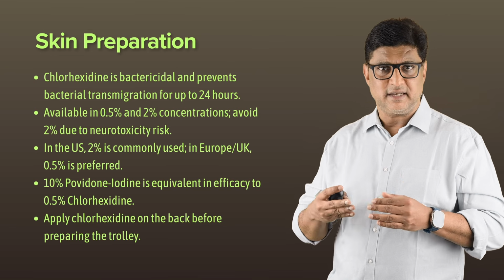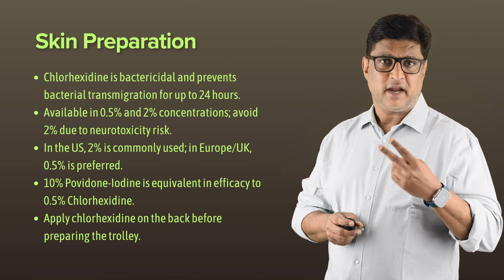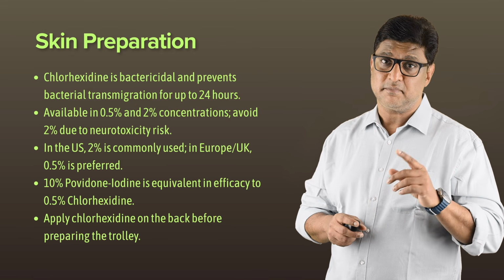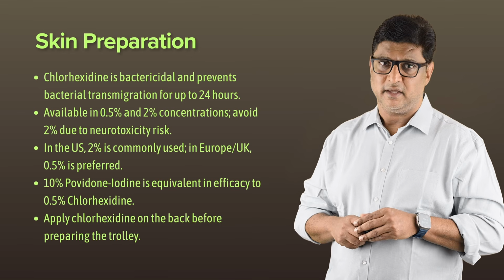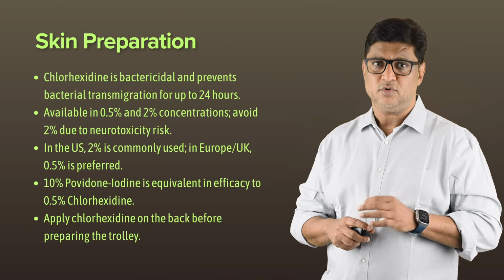In the US, it is recommended to use 2% chlorhexidine, and in the UK and Europe, 0.5% is preferred. And finally, remember, we have 10% iodine as well, which is roughly equivalent to 0.5% chlorhexidine and is also effective.